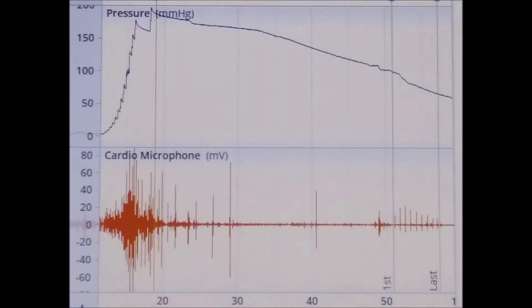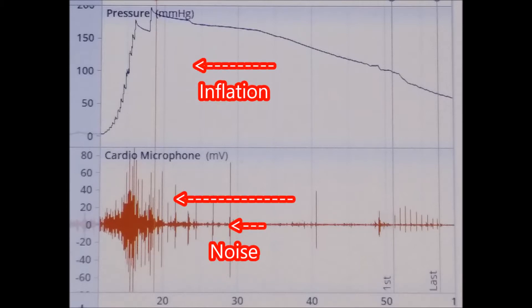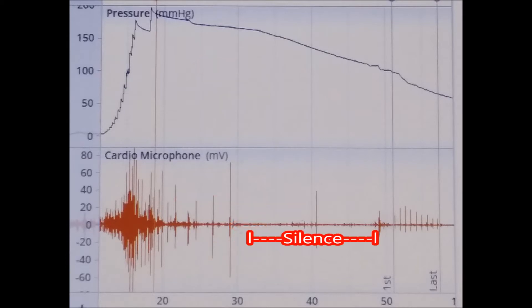Now we will analyze the data. During the analysis, we will discount the noise picked up by the cardio microphone as the blood pressure cuff was inflated. A period of silence is achieved when the systolic pressure is overcome and we slowly begin to release the pressure in the cuff.